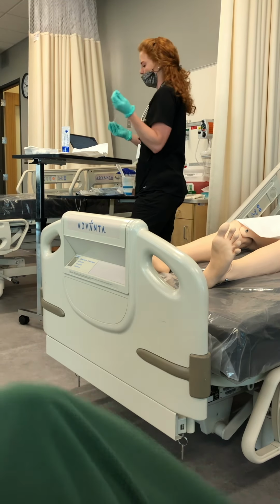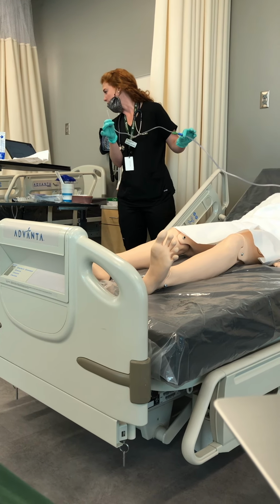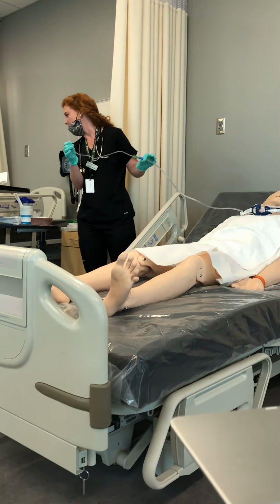That's going to be your sterile basin. Then with that non-dominant hand, you're going to pick up the suction tubing and connect the two ends. This hand right now is my sterile hand, and this is my non-sterile hand. So I'm going to connect the two of these together. And then I've got the rest of my catheter here. So unwrap the suction catheter so the tip is in the dominant hand and the catheter's vent is in your non-dominant hand, which is where we use our occlusion. Dip the tip of the catheter into the basin.